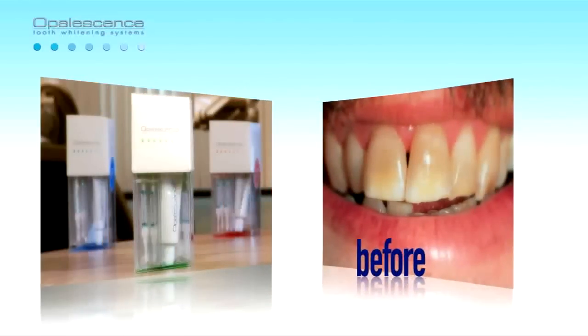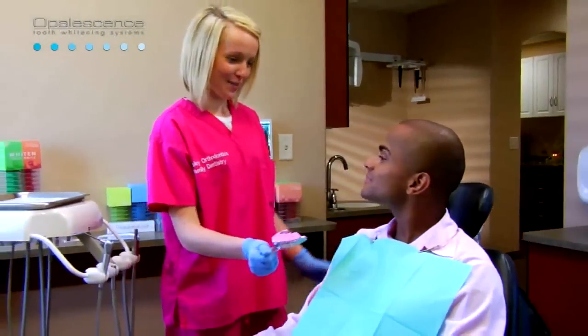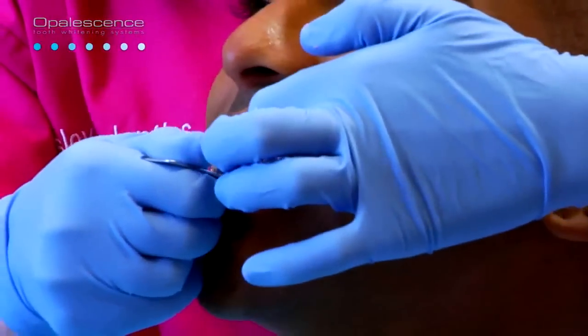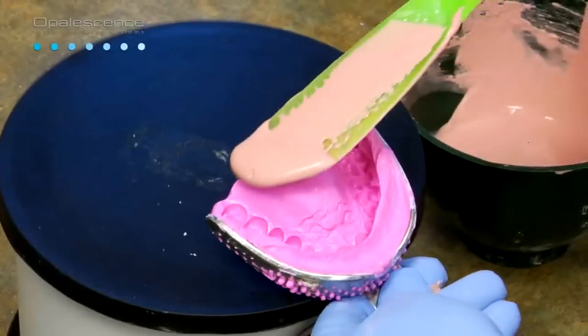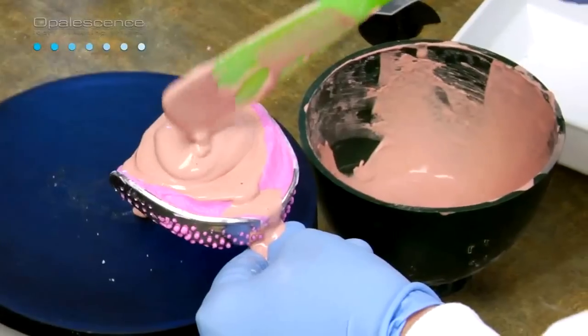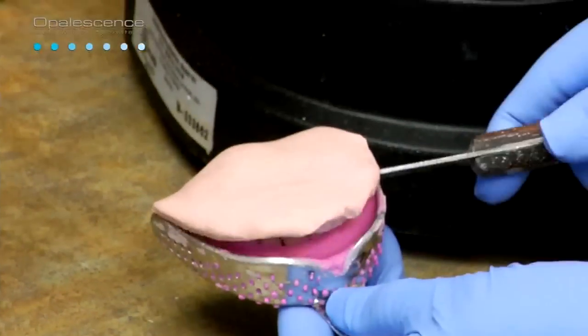Opalescence provides a more conservative modality of treating dark, discolored teeth. The first step in fabricating custom trays for whitening is to take an alginate impression of the patient's upper and lower arches. Fabricate the tray by pouring the alginate impression with fast-set plaster or dental stone. To ensure accuracy, do it shortly after making the impression.